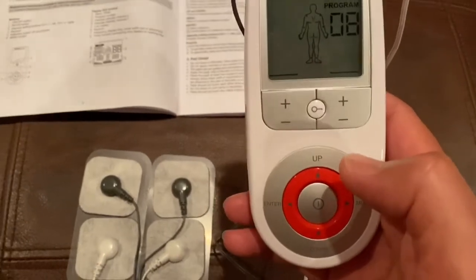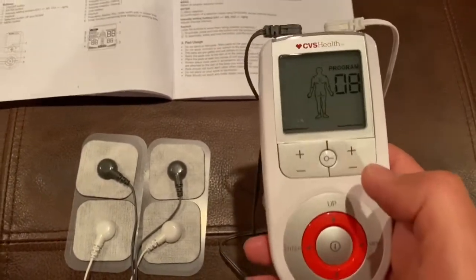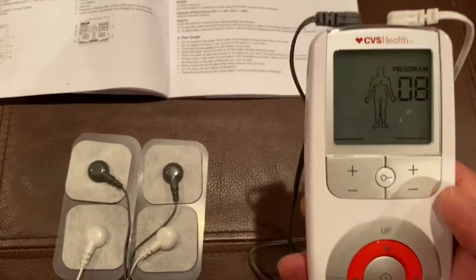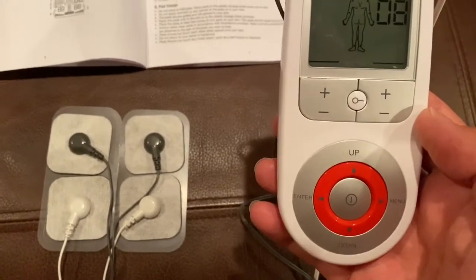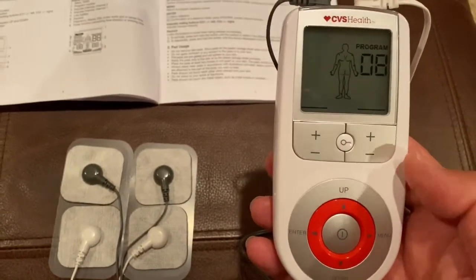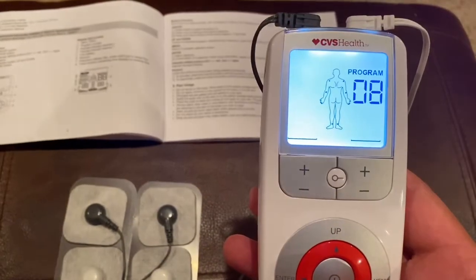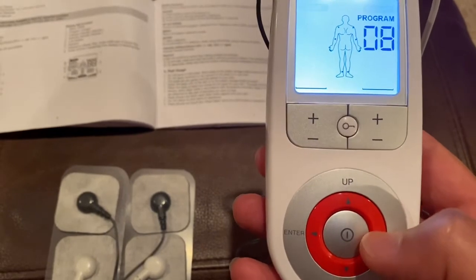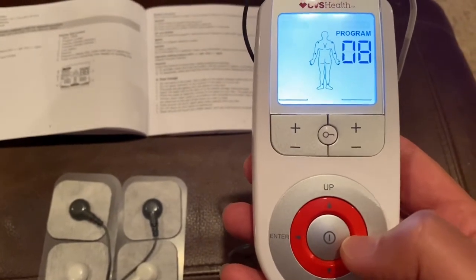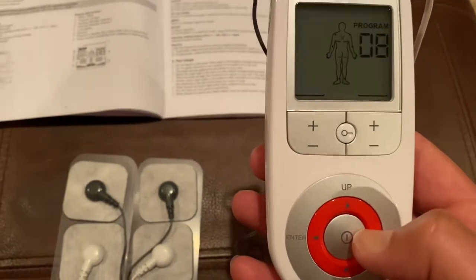Program 8 is kind of for arthritis. If you look through here, there's all kinds of programs — back pain and others. I think there are 14 different programs. I use 8 mostly just because I need some stimulus in my shoulder. You can work with the menu using the up and down buttons. Right now we're in the TENS unit on Program 8.